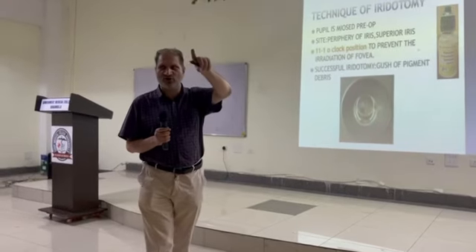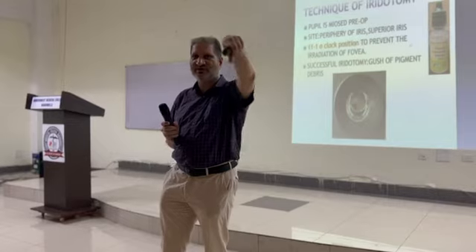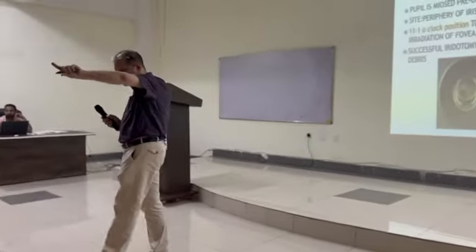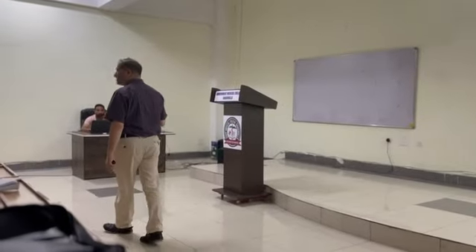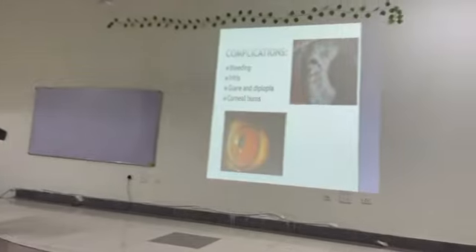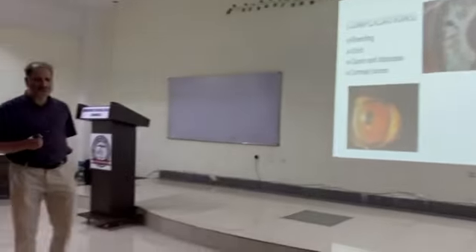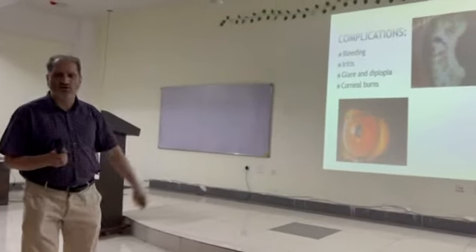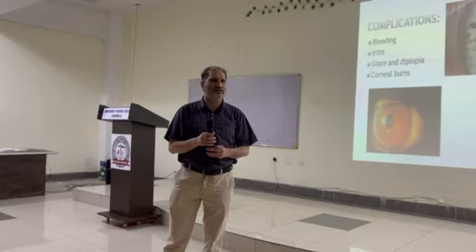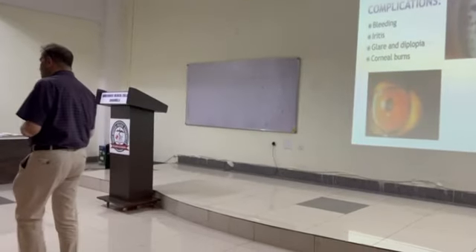Suppose you have used the laser and you go deep, there is an injury to the capsule of the lens, and it can cause cataract formation. So, complications I told you. And one more complication is the corneal burn. If you have not focused it on the iris and the laser beam hits the cornea, then it becomes a corneal burn.